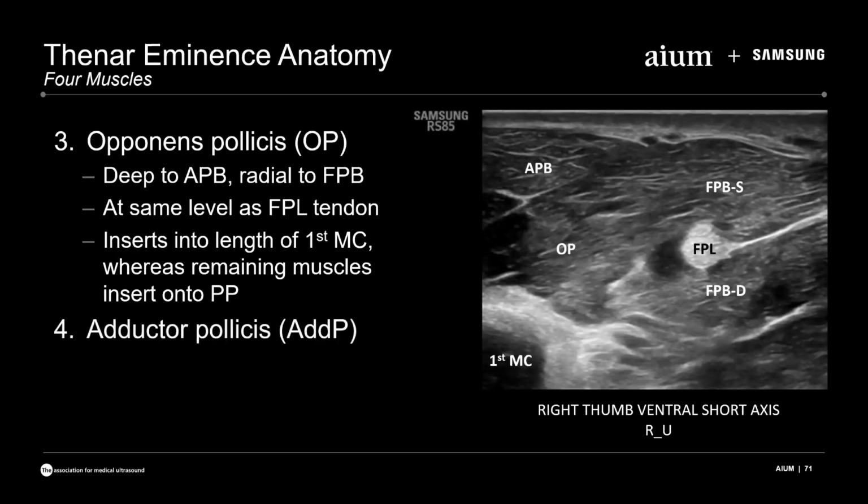And then finally, the fourth is this deeper adductor pollicis muscle. And you'll see that's deep to the flexor pollicis brevis. All right, so let's apply some of that anatomy to a case.